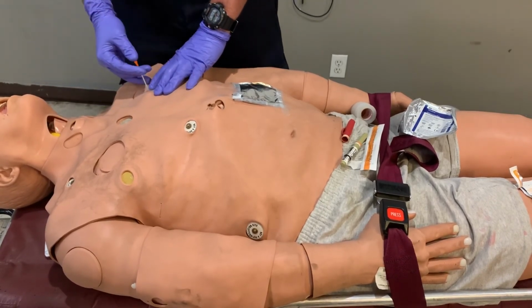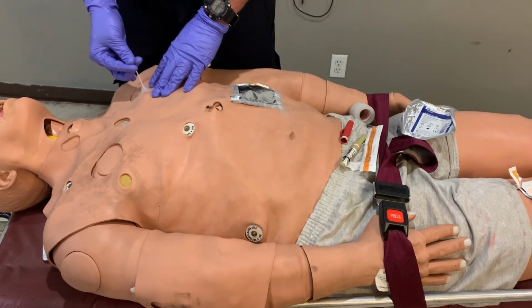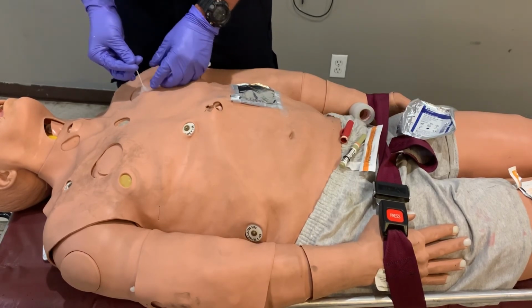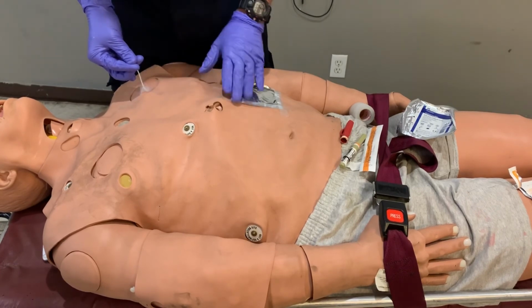If you don't have a switch, like I don't, you'll have to find some way to seal the hole, and whenever there's no more air coming out of the needle, you'll then transport, and then that'll be all.